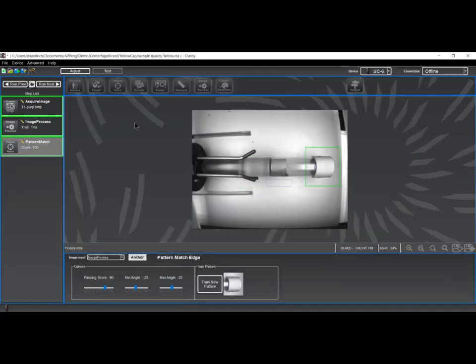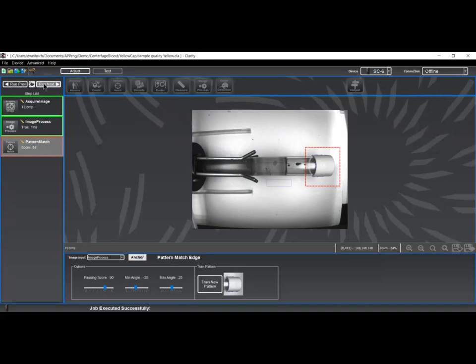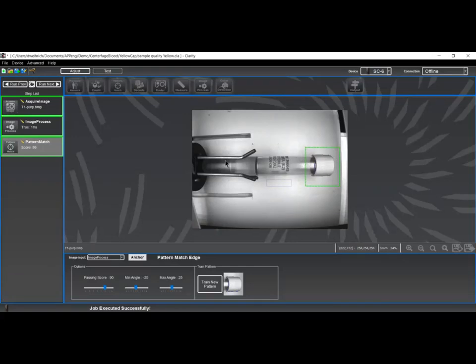If we take that and then work through our different pictures, you can see that some of them do not respond well enough to finding that. So we have to go through an iterative process of giving it a matching score, minimum or maximum angle. This step uses the image processed picture from the previous step. Any one of these steps can use the original acquired image or can use the image processed image.